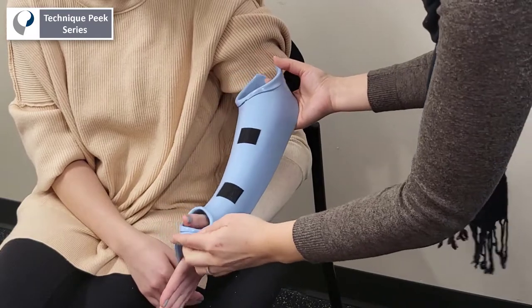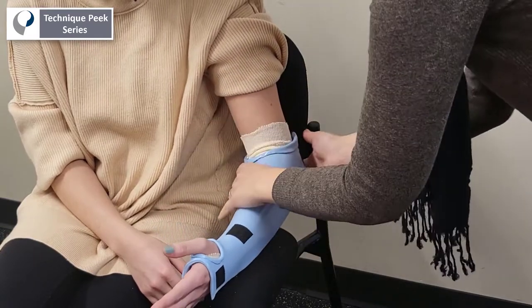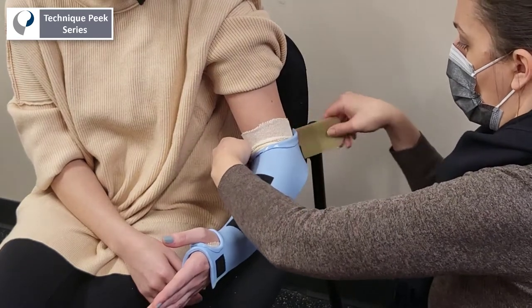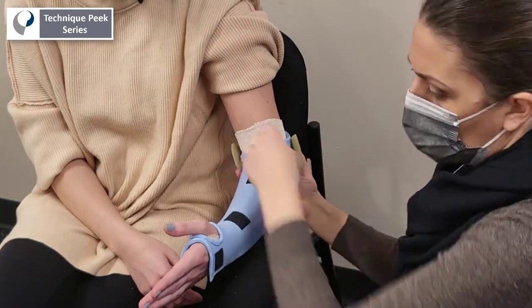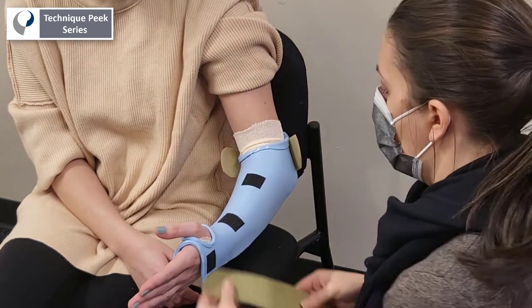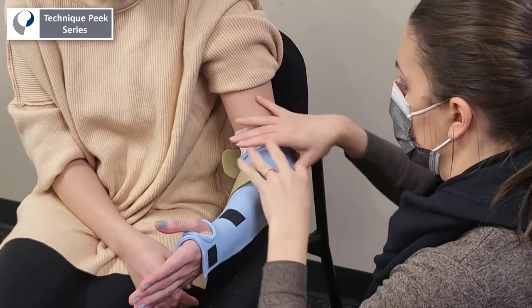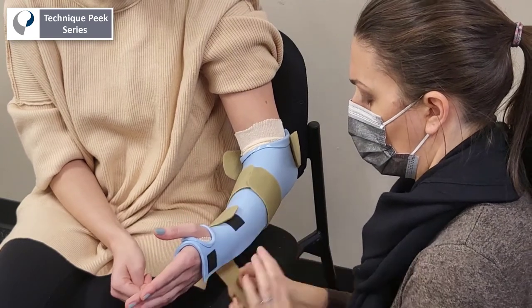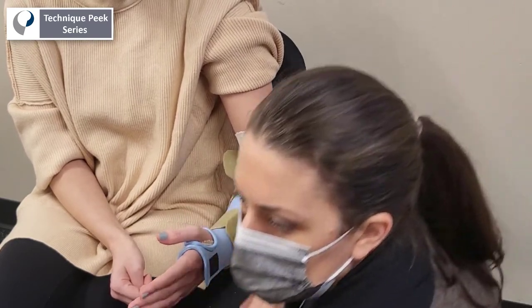Once you've cut away the extra material, you'll want to add the straps. Replace the splint and put one strap posterior to the elbow, the next strap at the proximal forearm, an additional strap at the wrist crease, and finally a strap at the level of the distal palmar crease.